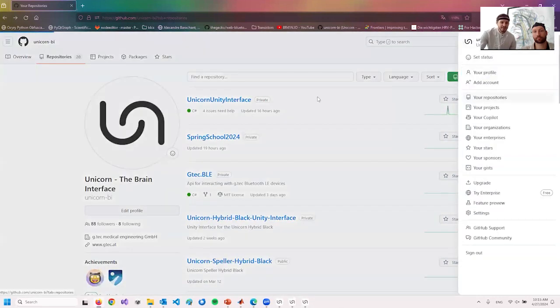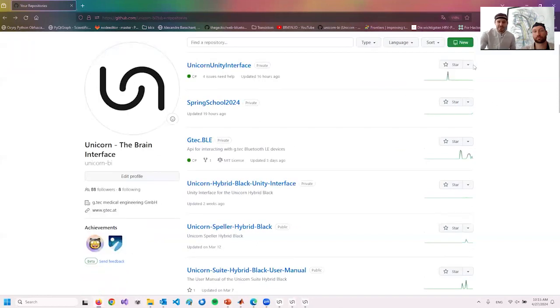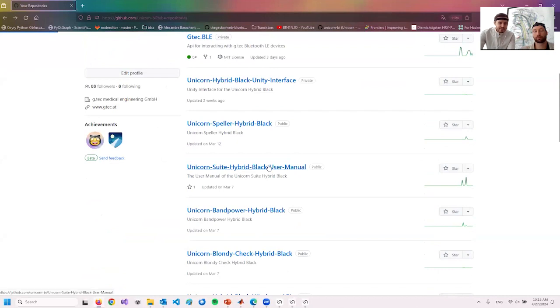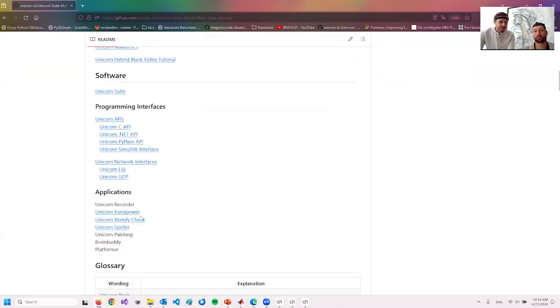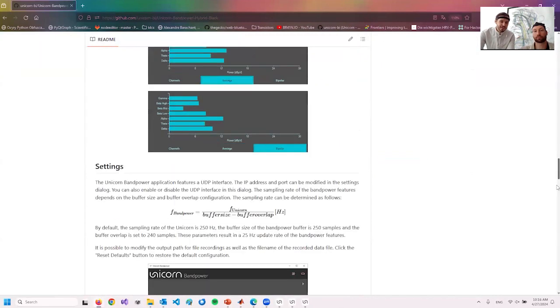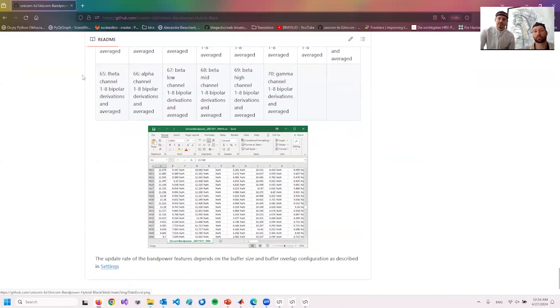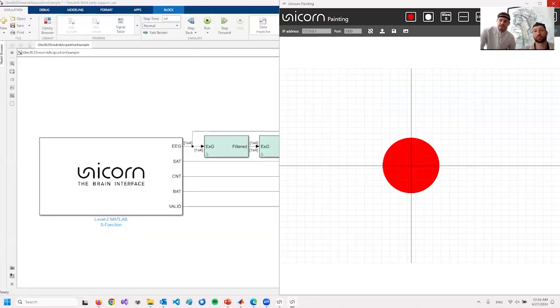So I ask you to please check the manual first, because most of the software should be documented there, and you should find some information there. So here's the software manual. Whatever software you want to use, like for instance, you want to use the band power tool, you will find a section for the capabilities of the band power here, like how the UDP package would be structured if you send it, how the CSV file is structured if you record data, and so on. And these were the applications.